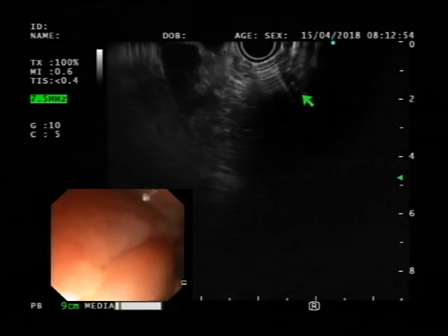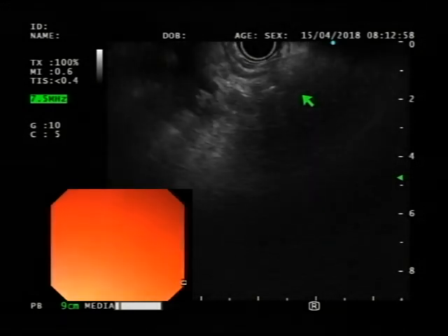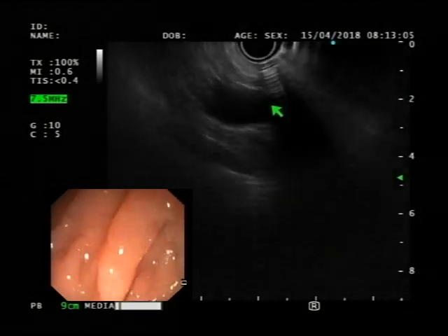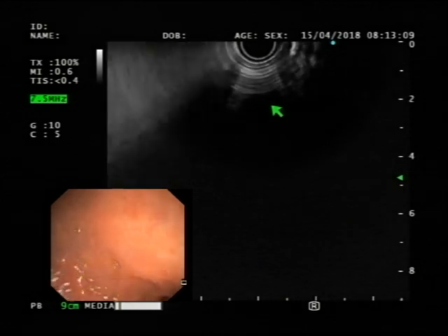Okay? Reduce the scope, reduce, okay. You are beyond that step, okay. Now you definitely have to unlock it, okay. Now big wheel towards you. You're falling back. Okay.